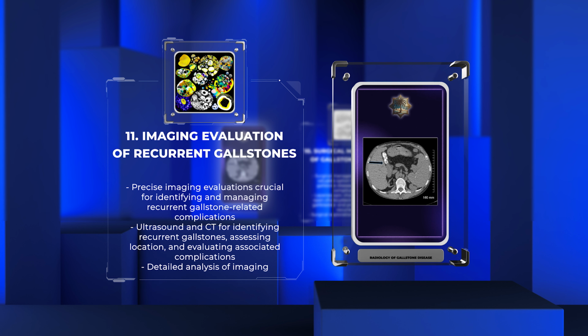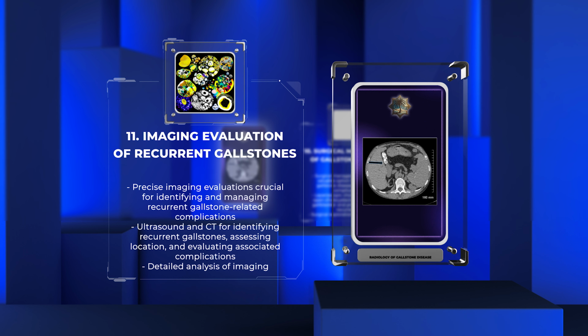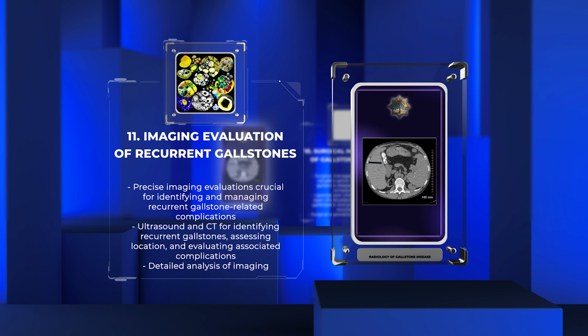Professor, imaging techniques such as ultrasound and CT help identify recurrent gallstones, assess their location, and evaluate for associated complications. Detailed analysis of imaging findings and correlation with clinical symptoms ensure appropriate intervention, whether it be medical management or additional surgical procedures. Scene transitions to the title of the final topic.